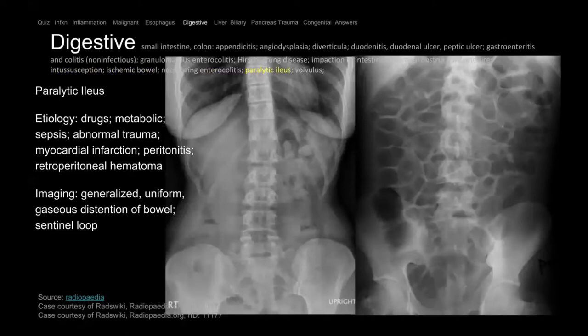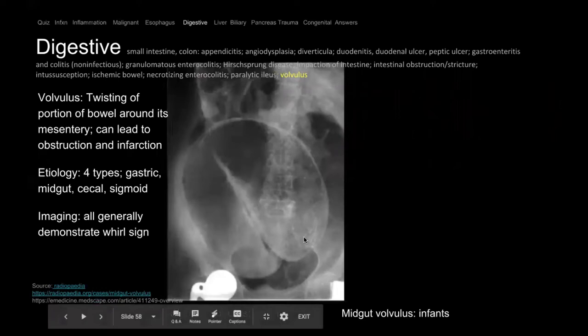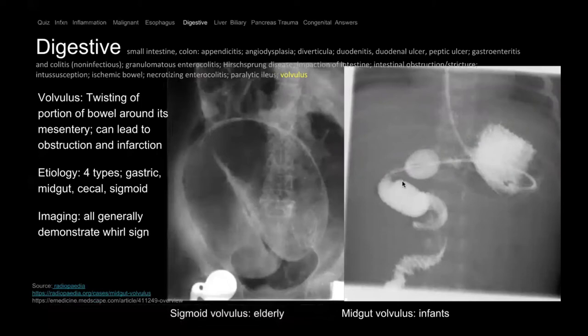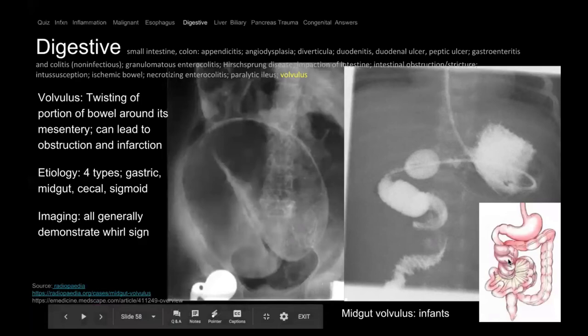Volvulus — on this radiograph there's abnormal twisting of bowel in a bean shape. This is sigmoid volvulus. In a child, the stomach is here, the duodenum forms the gastroduodenal junction, but there's twisting that stays on the right side — this is called malrotation. The cartoon version shows the bowel didn't migrate to the appropriate place — it's on the right side with a very short, narrowed pedicle instead of a normal broad mesentery. It can twist on the pedicle and cause volvulus — volvulus complicating malrotation.